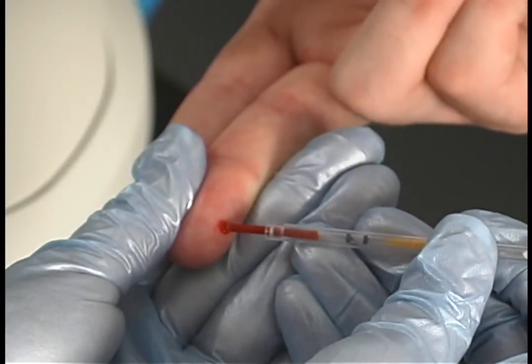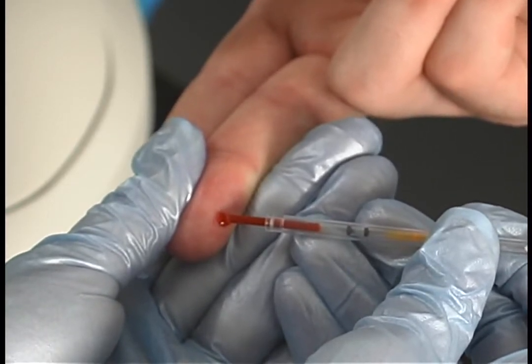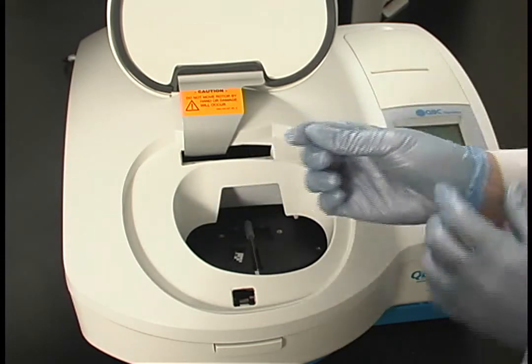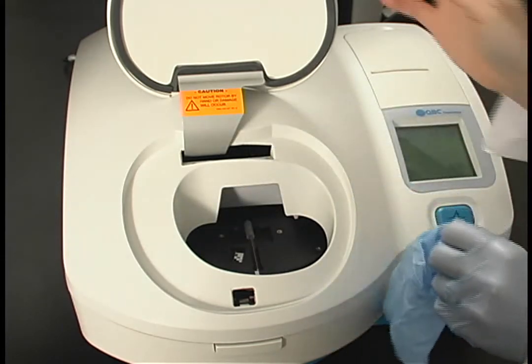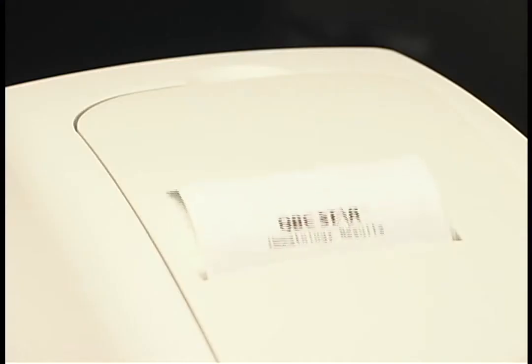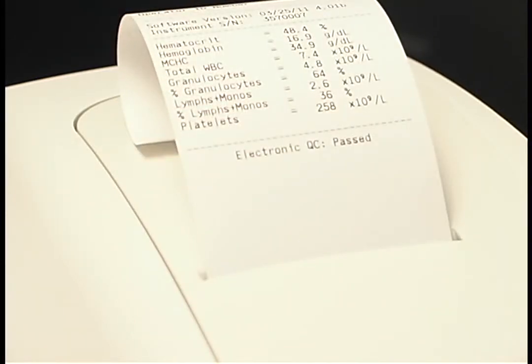The only thing to discard after testing is the STAR tube, and there is no mess to clean. Simply collect your patient sample into the STAR tube, place the tube into the instrument, close the door, and press the blue STAR button. The STAR will centrifuge, analyze, and print your CBC results. The STAR makes your patient testing easy, efficient, and hassle-free.